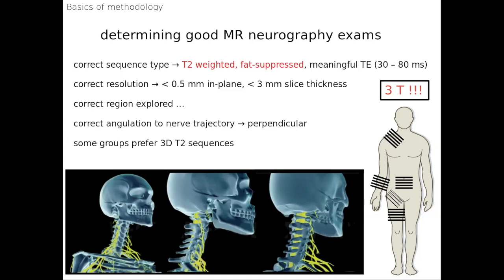So really, as we know, the different neurological questions of peripheral nerve require quite flexible access. Just as if you do the electrophysiological exams tailored to the question you want, you also need to do that with the MR neurography to have really at the end the question solved you asked for. So you need to talk to your radiologist and do the exam with him.